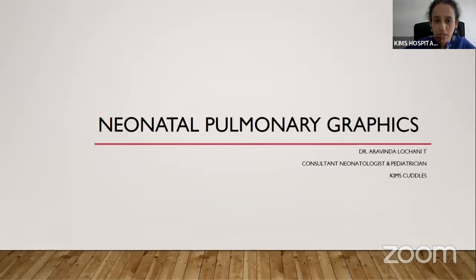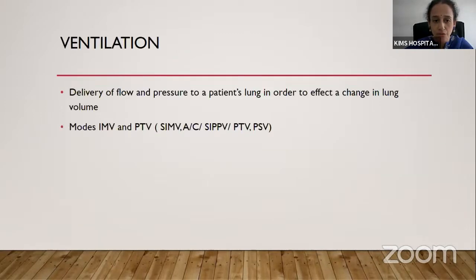Okay, I'll start my presentation now. Today we will discuss the pulmonary graphics in neonates. In the last two sessions of KIMS online presentations, we have learned about the basics of ventilation. So we'll have a brief recap of what you have learned already, and then we'll go to the pulmonary graphics.